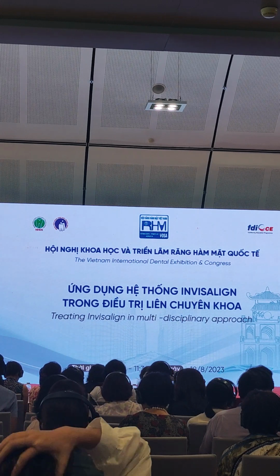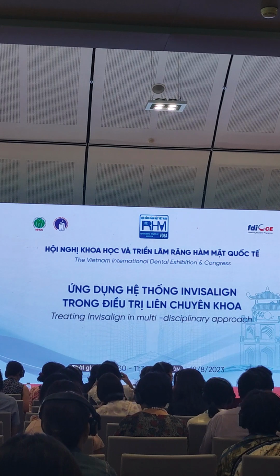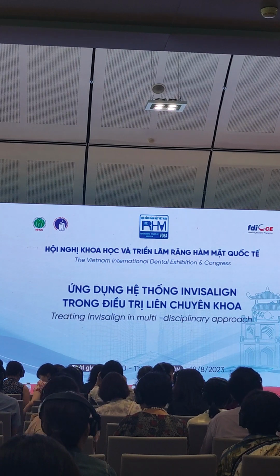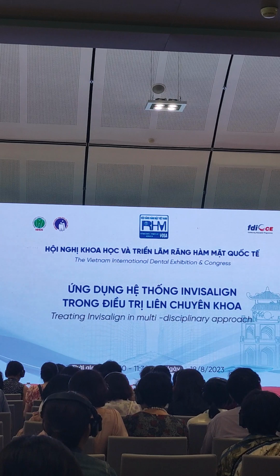Can you ask again? I cannot hear. After the orthodontic treatment, do you see there will be some premature contact or occlusion interference in some teeth? If you see it, do you do the adjustment right away, or do you wait for a while for the occlusion to settle?